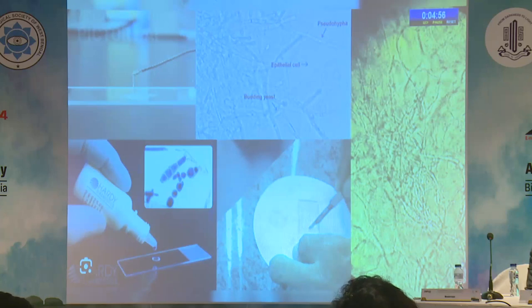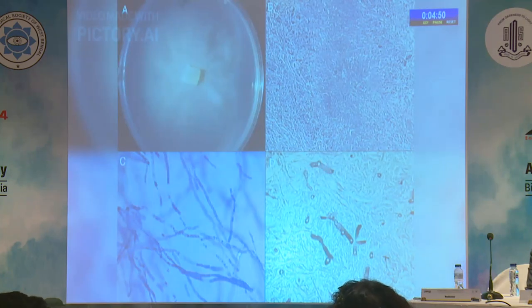The growth characteristics of Pythium species are observed under specific incubation conditions. Histopathological stains such as hematoxylin and eosin, periodic acid-Schiff, and Gomori methenamine silver are used on formalin-fixed, paraffin-embedded samples to identify Pythium filaments. Various staining durations and reactions are employed to confirm the presence of Pythium.